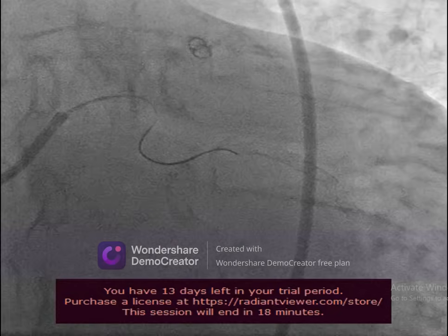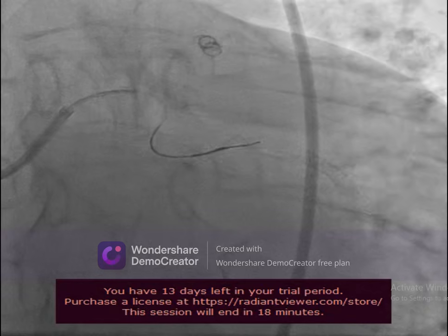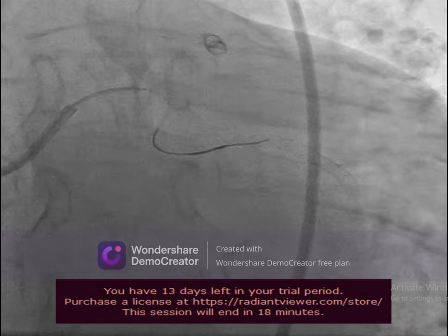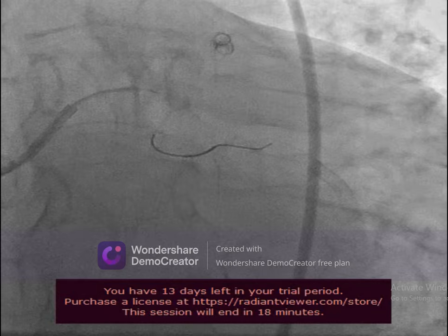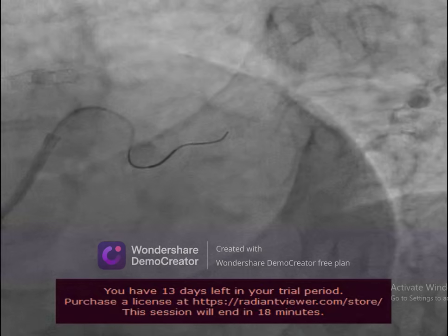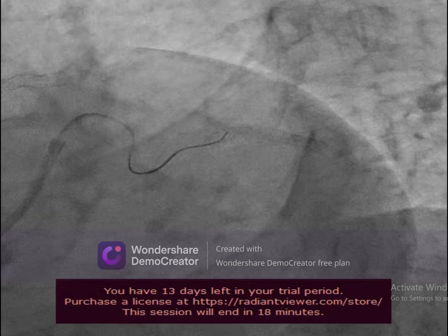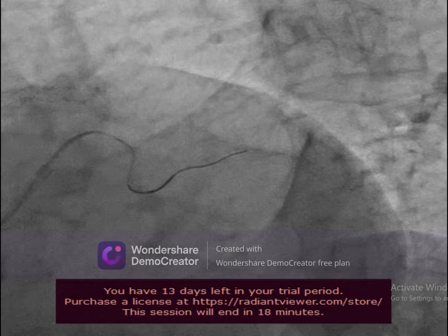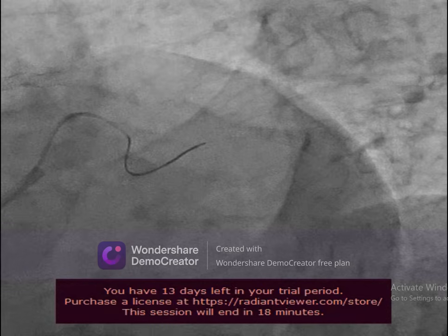As you see here, how the wire behaves, it is entering and penetrating the proximal cap, and I'm still inside the borders of the frame of the stent. I tried different projections and also withdrew and approximated the tip of the microcatheter to support. The wire advanced a little bit, but the system started to buckle again.